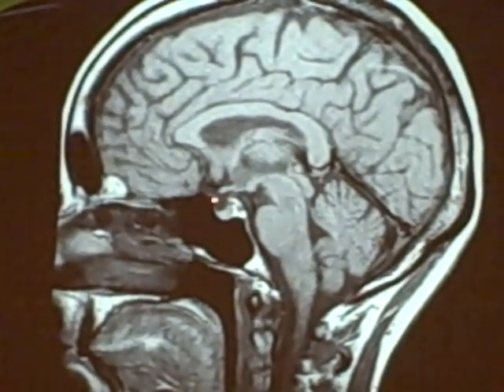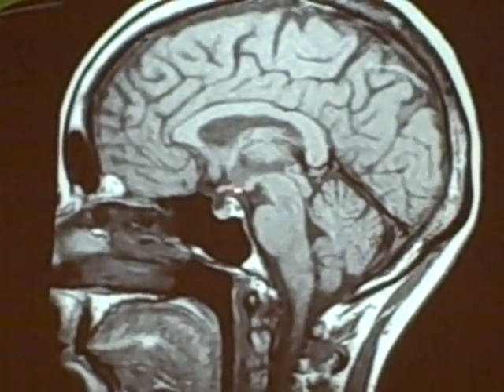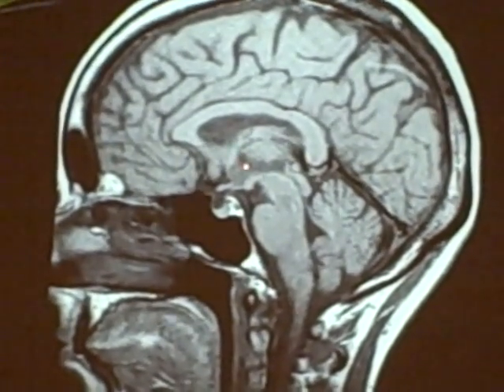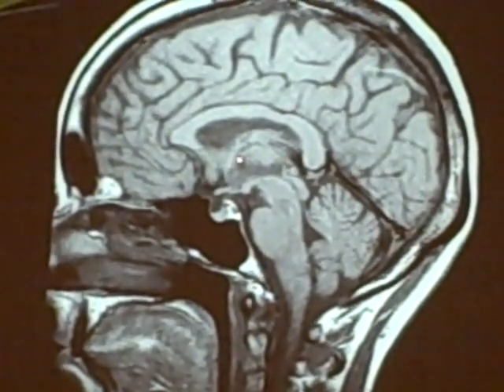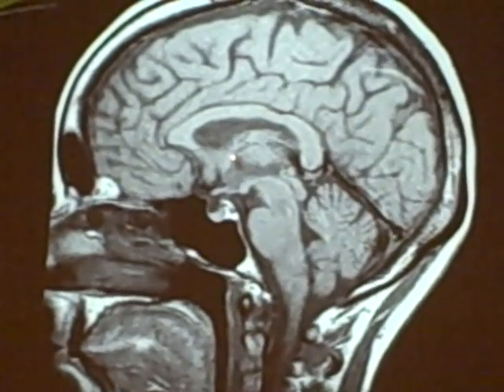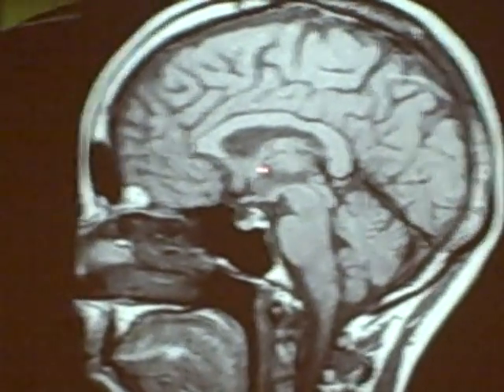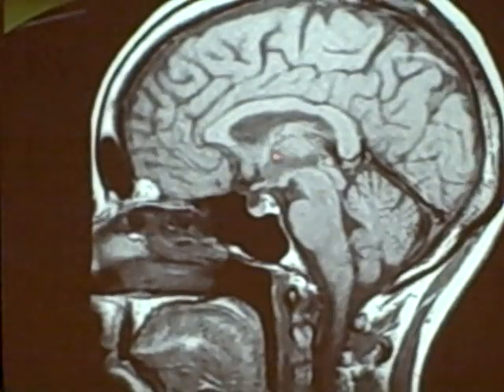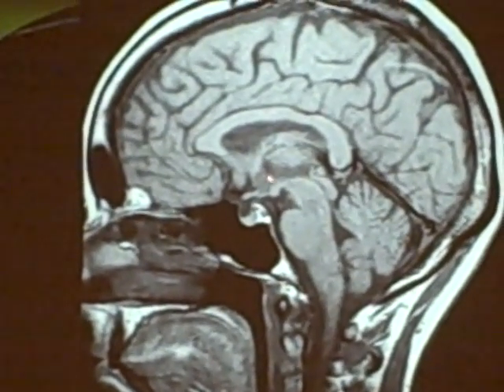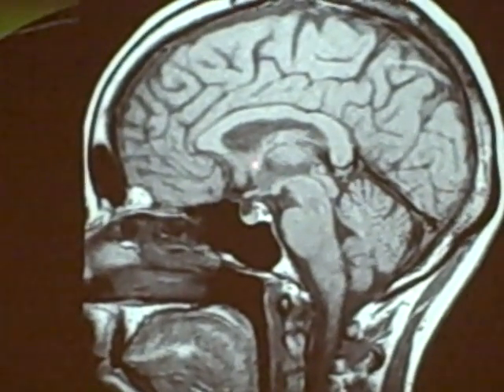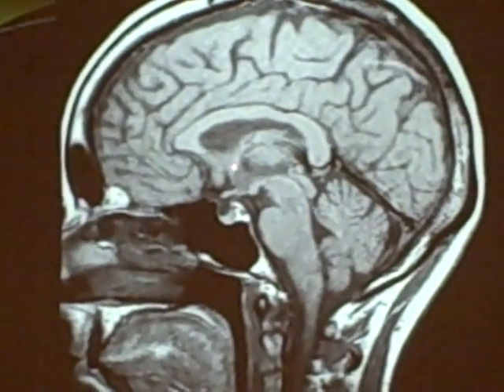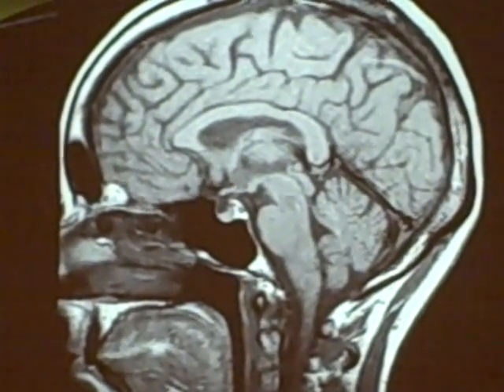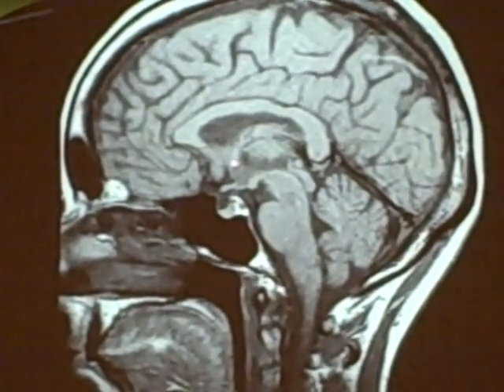Below the optic chiasm is the pituitary. Coming up in here, this is the interventricular foramen of Monroe. CSF, as it gets from the lateral ventricle into the third ventricle — which is this space right in here — gets there via the foramen of Monroe. And then we have the anterior commissure right here, a pathway that connects the right and left temporal lobes.